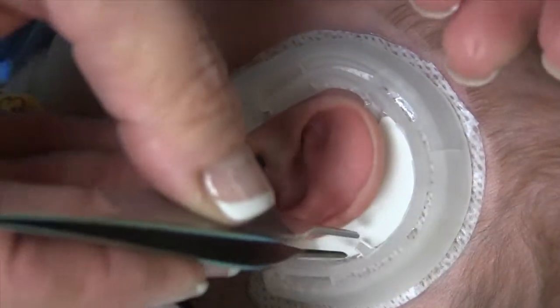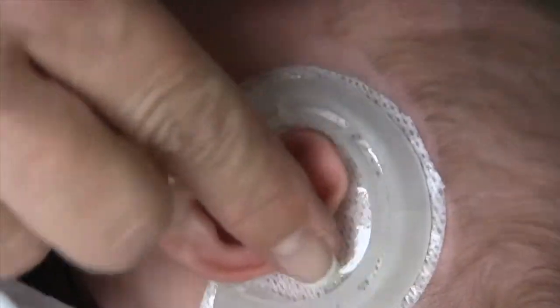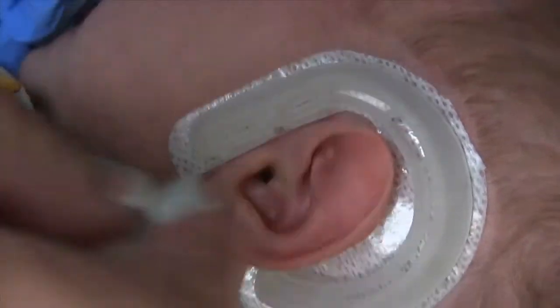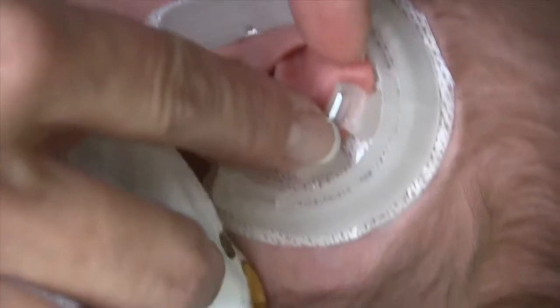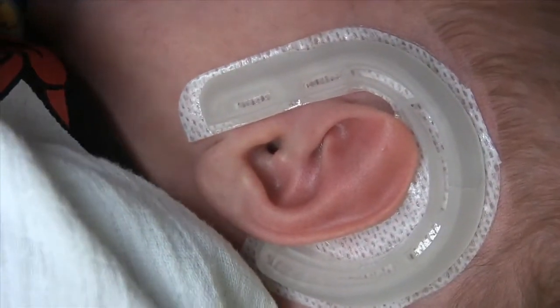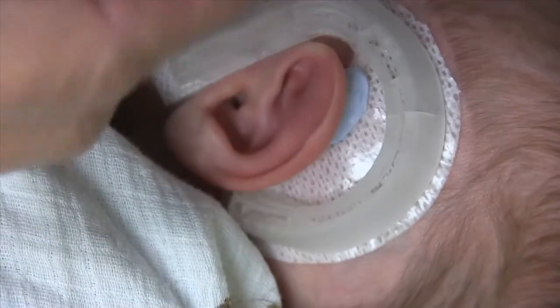In the meantime, I'll start to take out the tapes here to prepare this. I'm going to put a little bit over the posterior former because I want to be able to get this superior crus form. But when I do that, it flattens out the top of the rim, so we want to be able to curl that in. I'm putting this around the control former to kind of soften that angle at the top.